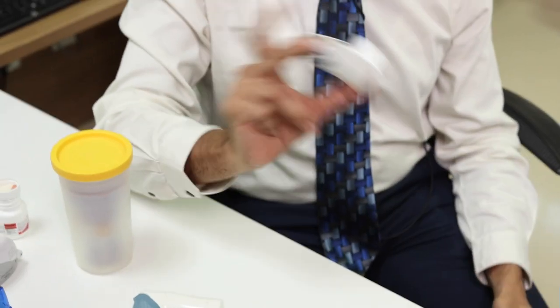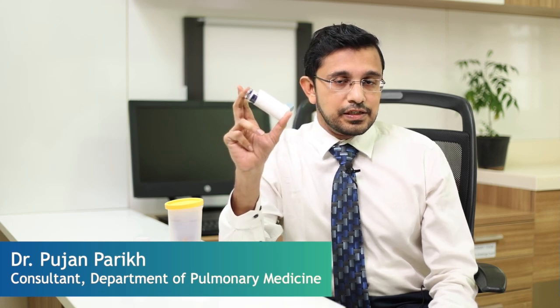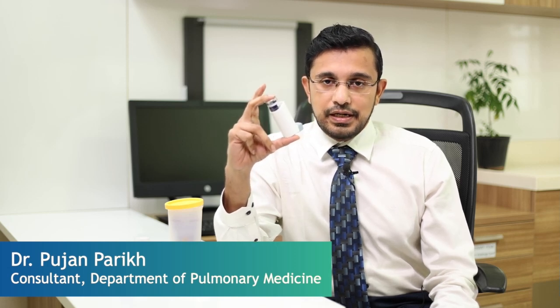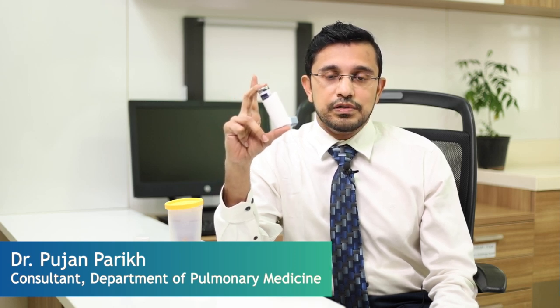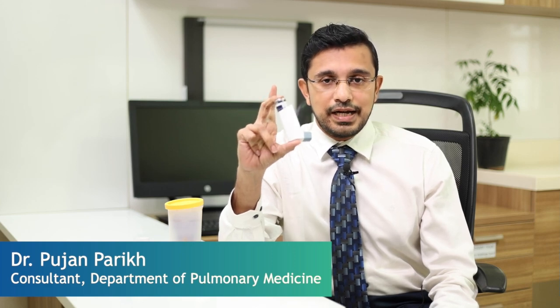How to take it properly? First, the patient has to shake it properly before taking the inhaler. Then the patient has to breathe out. Then keep this inhaler in the mouth and close the lips around it properly. The patient has to press this inhaler and at the same time take a long deep breath and hold the breath for 10 to 15 seconds. So this is how the MDI should be taken.